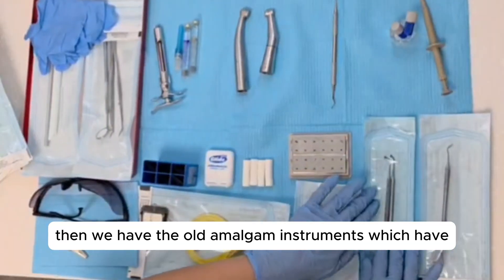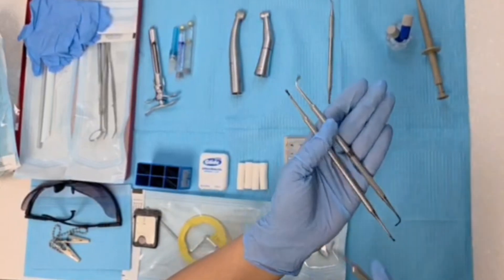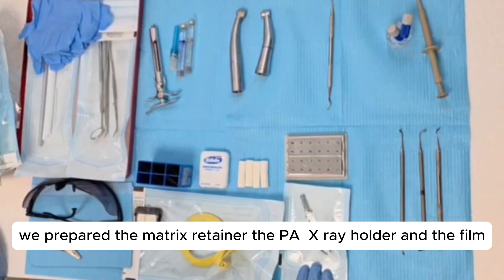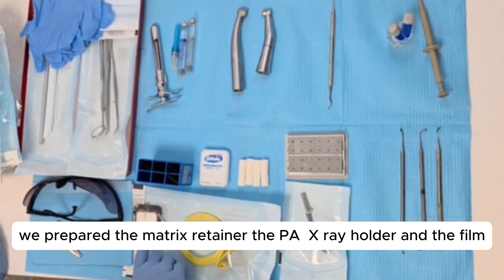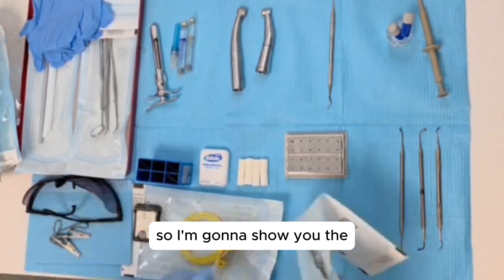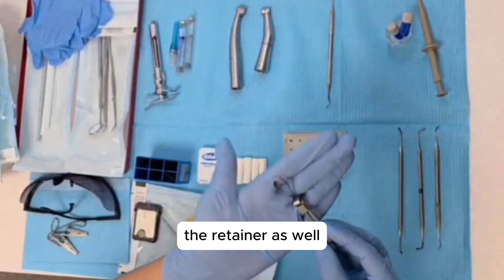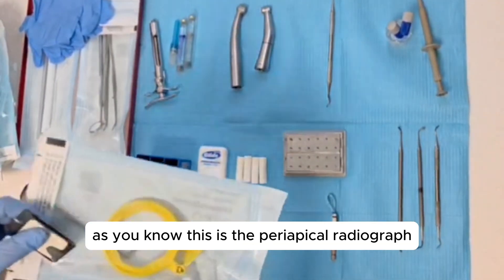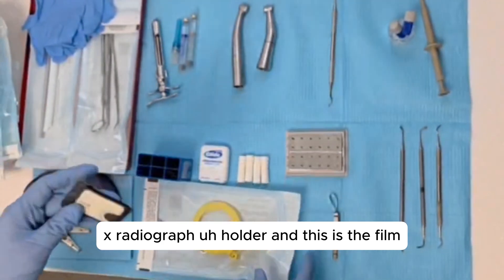Then we have the amalgam instruments, which include the amalgam packer and amalgam carver. Additionally, we prepared the matrix retainer, the periapical x-ray holder, and the film. This is the retainer, this is the periapical radiograph holder, and this is the film.